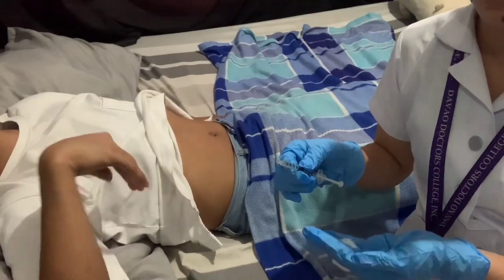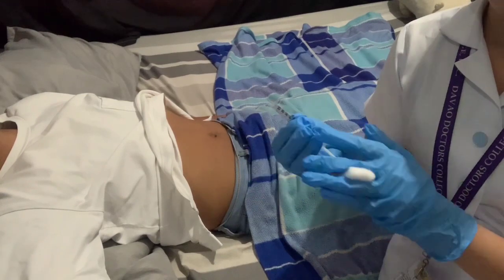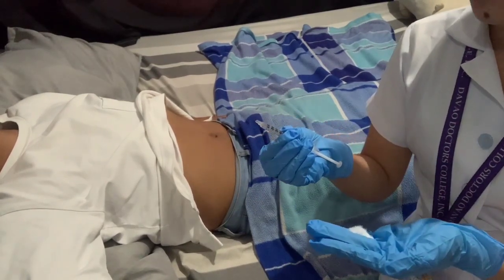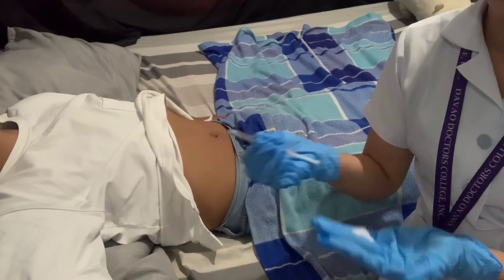So we are going to grasp the syringe with our dominant hand by holding it between the thumb and the fingers. So we are going to place this facing to the side or upward for a 45-degree angle insertion.